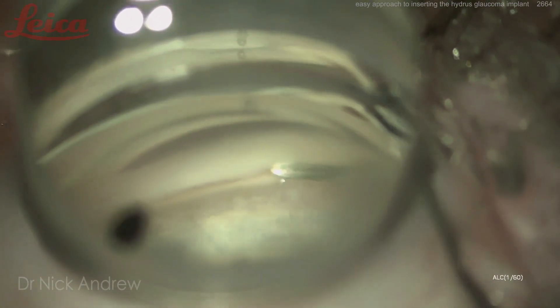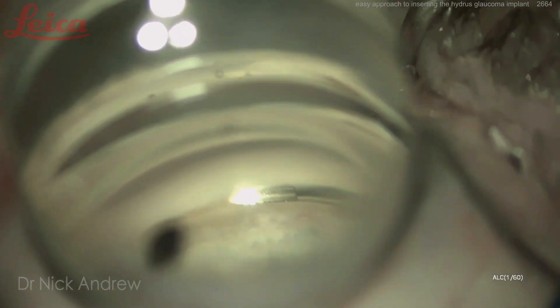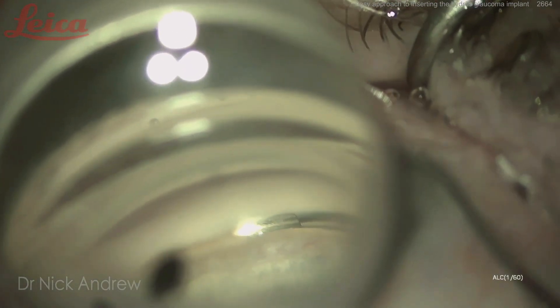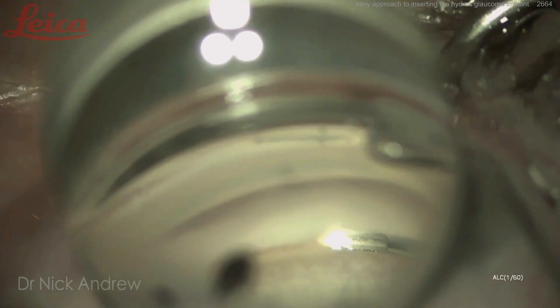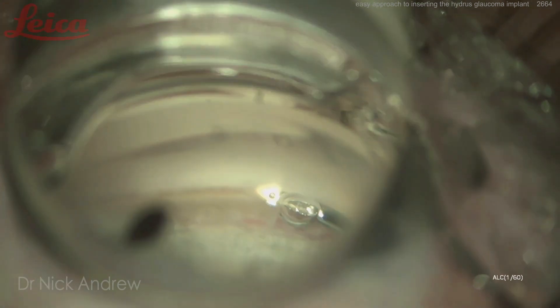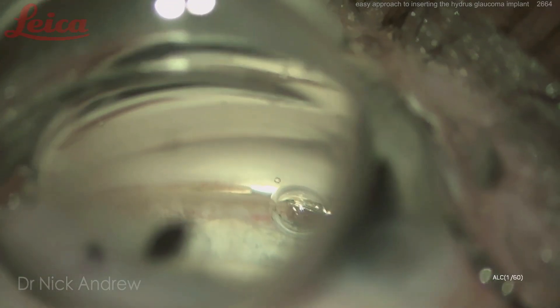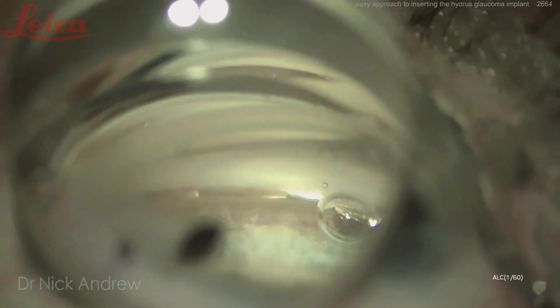Here's another case. As I pierce the trabecular meshwork, I'm working harder than usual because these eyes are overinflated with viscoelastic to get better video quality, making it more challenging to embed the injector into Schlem's canal. Pushing forwards and relaxing the hand, with the injector angled about 10 degrees superiorly. Relaxing the hand with no outward pressure against Schlem's canal, and a very slow delivery of the Hydrus. There can be adhesions within Schlem's canal, so advance slowly and allow any adhesions to separate as the Hydrus is delivered.